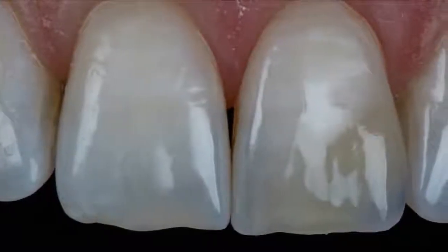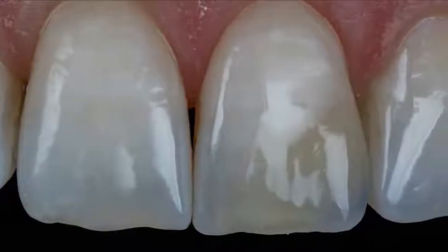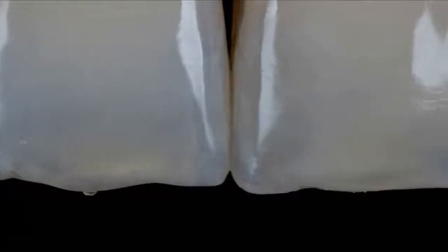This is the view of the restoration immediately after finishing in the same visit. And these few pictures show us the external view 2 days after finishing and polishing.